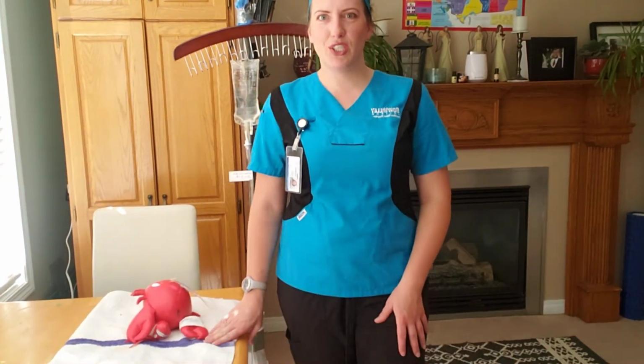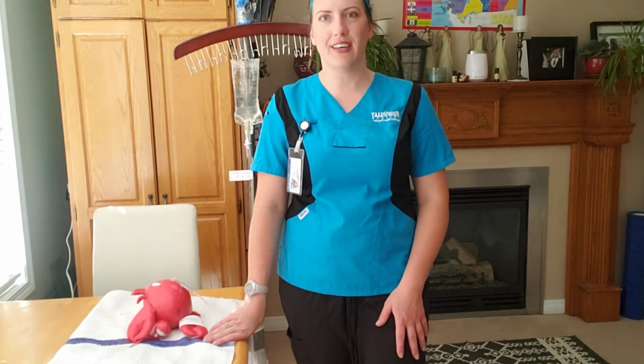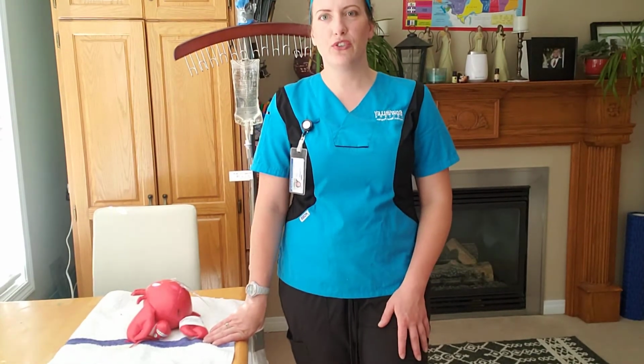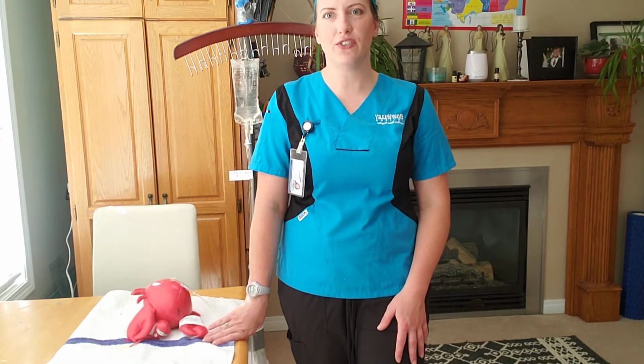Hi there, my name is Janine McIntyre. My student ID number is 344267, and today is a lab demonstration for intravenous piggyback medication administration. Here's my identification.